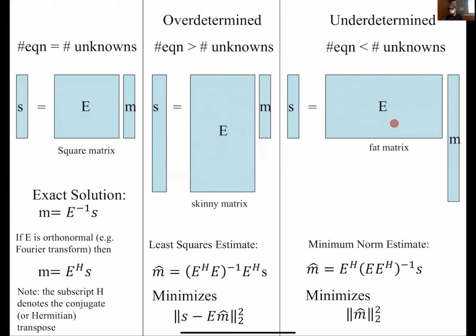But what we'd like to do is underdetermined, because obviously we don't have to acquire as much in K-space, so we can go faster. But we don't want the imaging artifacts. And so today's class is all about how do you go faster than you think you can? How do you break the Nyquist limit so you can go faster but not have artifacts? So today is sort of breaking the speed limit.